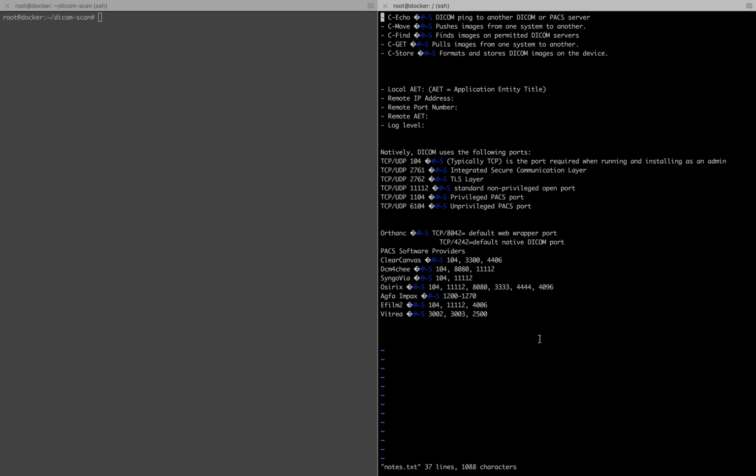I wanted to take this first video as kind of a documentation library of some independent research I've been doing around DICOM devices. DICOM devices are devices used in medical field operations for things like medical imaging, medicine distribution, those types of things. And so just kind of getting into it here so I don't take up all your day.